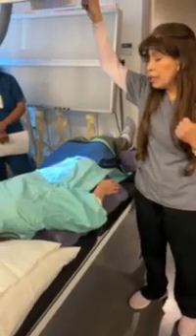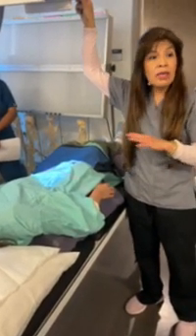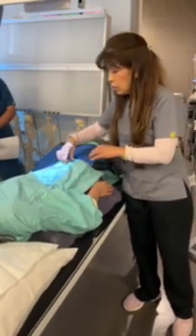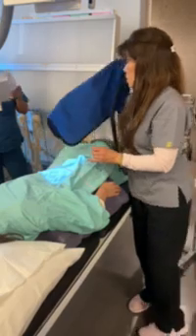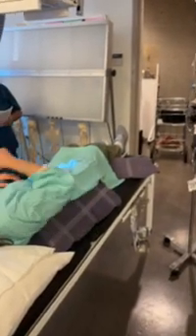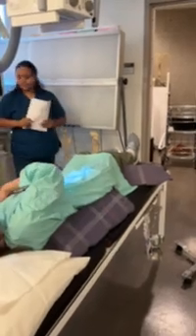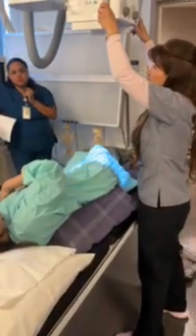The post void, either supine or upright. So what I'm gonna do right now, she's going to get up and go to the restroom, okay? And we're gonna do the image upright. What's the reason I wanna do the upright voiding? For the mobility of the kidneys. Mobility of kidneys, or what are we looking for?